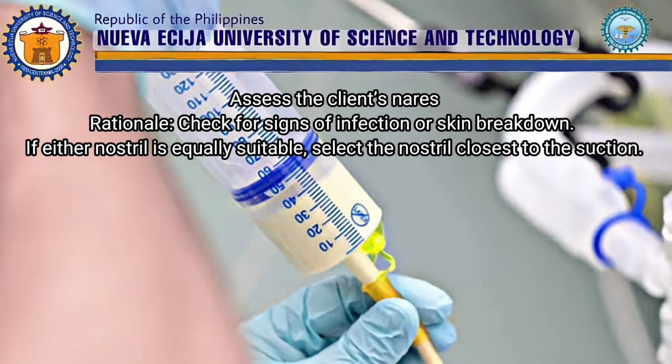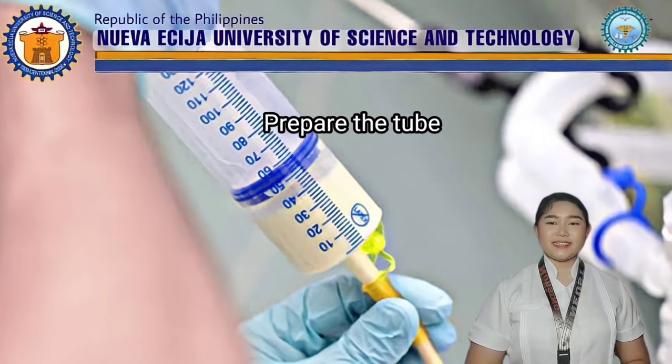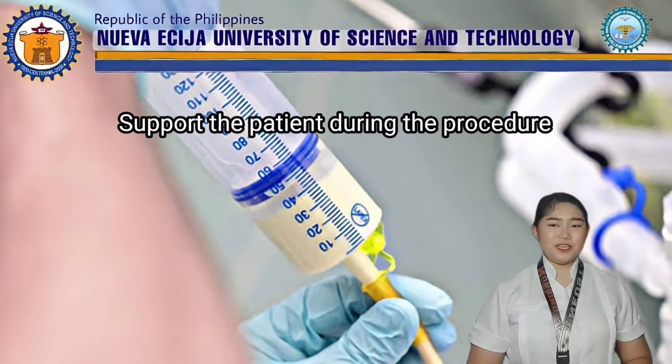Assess the client's nares. Rationale: check for signs of infection or skin breakdown. If either nostril is equally suitable, select the nostril closest to the suction. Prepare the tube. Support the patient during the procedure.